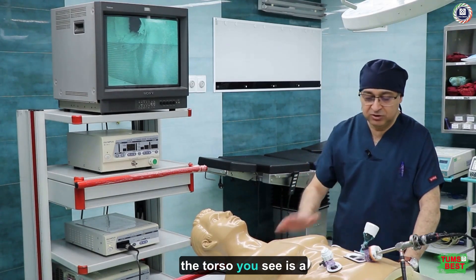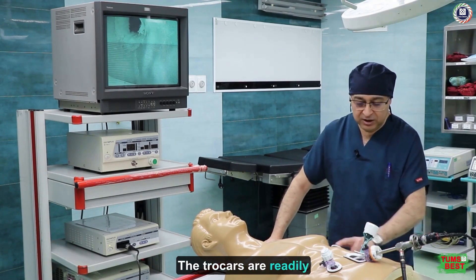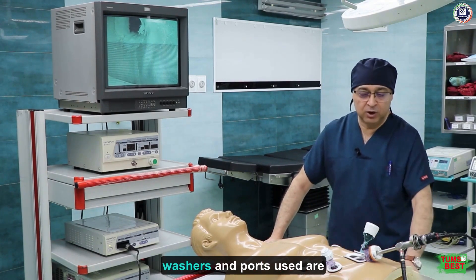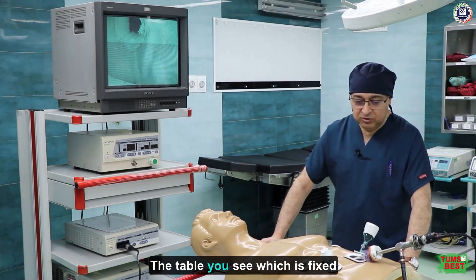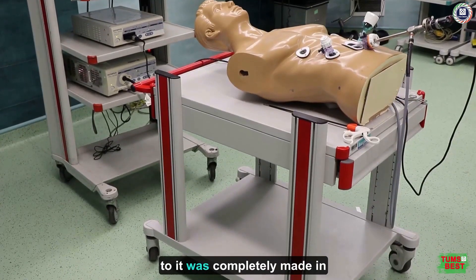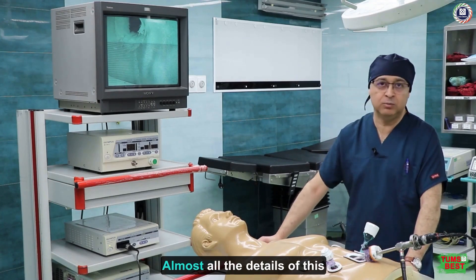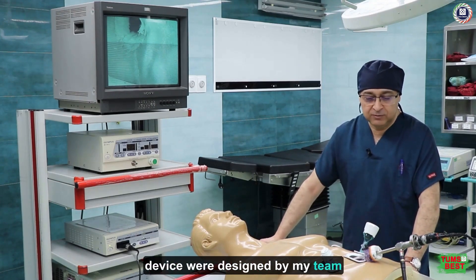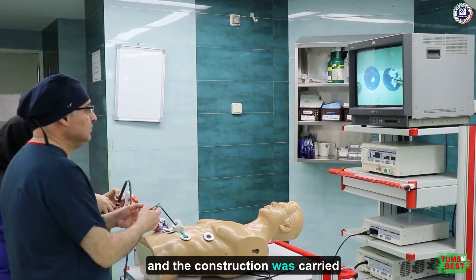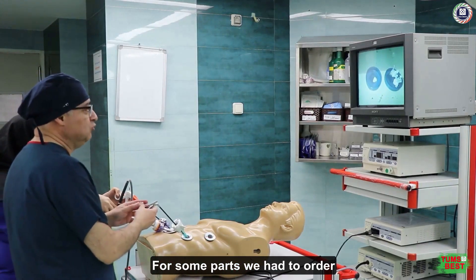The design of the device is very simple. For example, the torso you see is a mannequin we used. The trocars are readily available in the market, and the washers and ports used are entirely our own design. The table, which is fixed to it, was completely made in Iran and was ordered by us. Almost all the details of this device were designed by my team, and the construction was carried out by colleagues at the hospital.